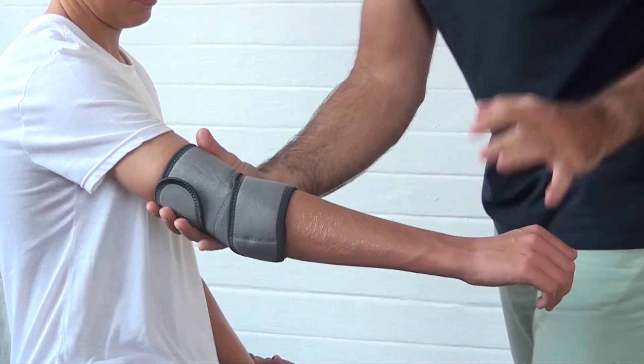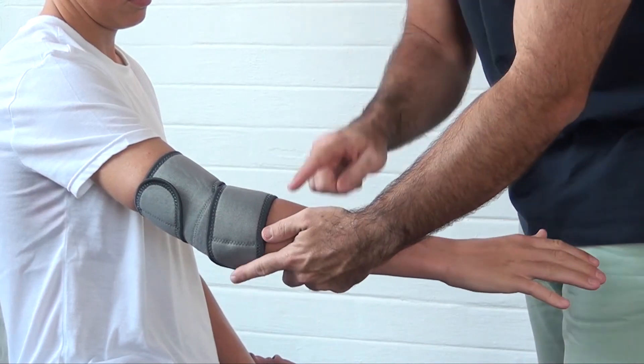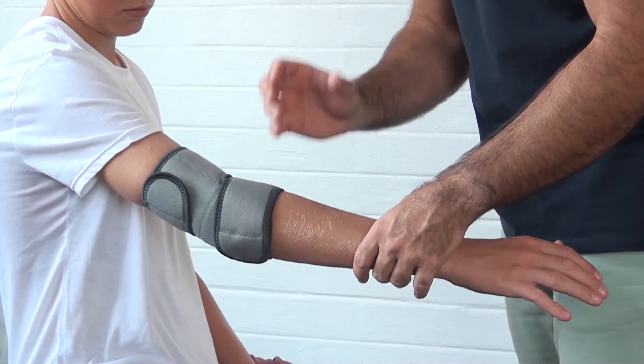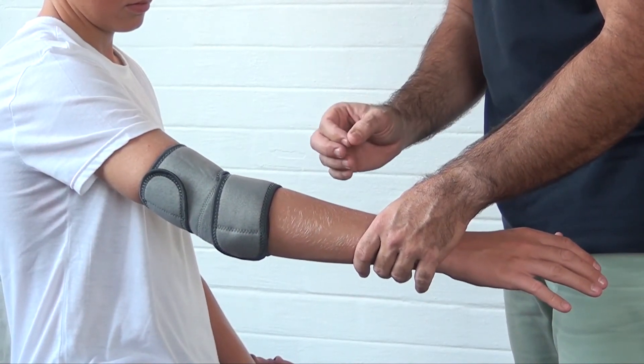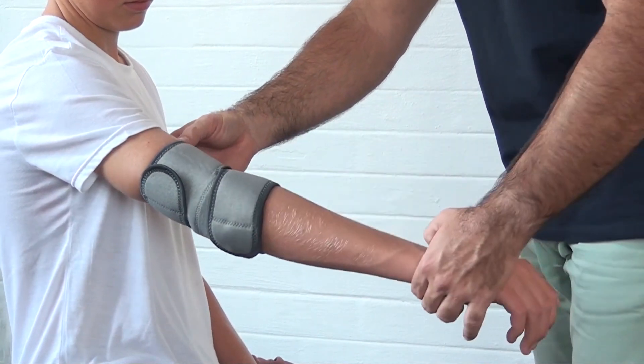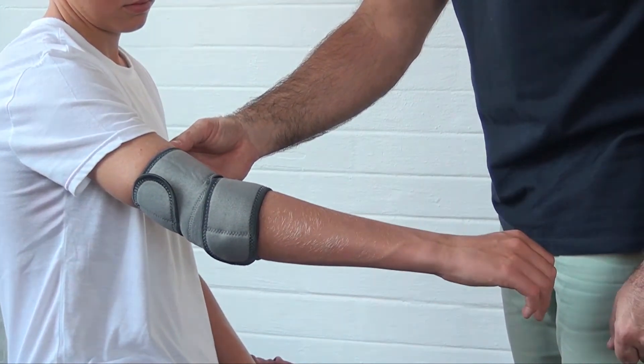Have the patient flex their muscles in their forearm to make sure it's not too tight. Take a finger to test and make sure the upper and lower attachments are offering firm compression support without compromising blood supply. Have the patient flex their elbow two or three times to make sure it's comfortable and they've got a natural range of motion.